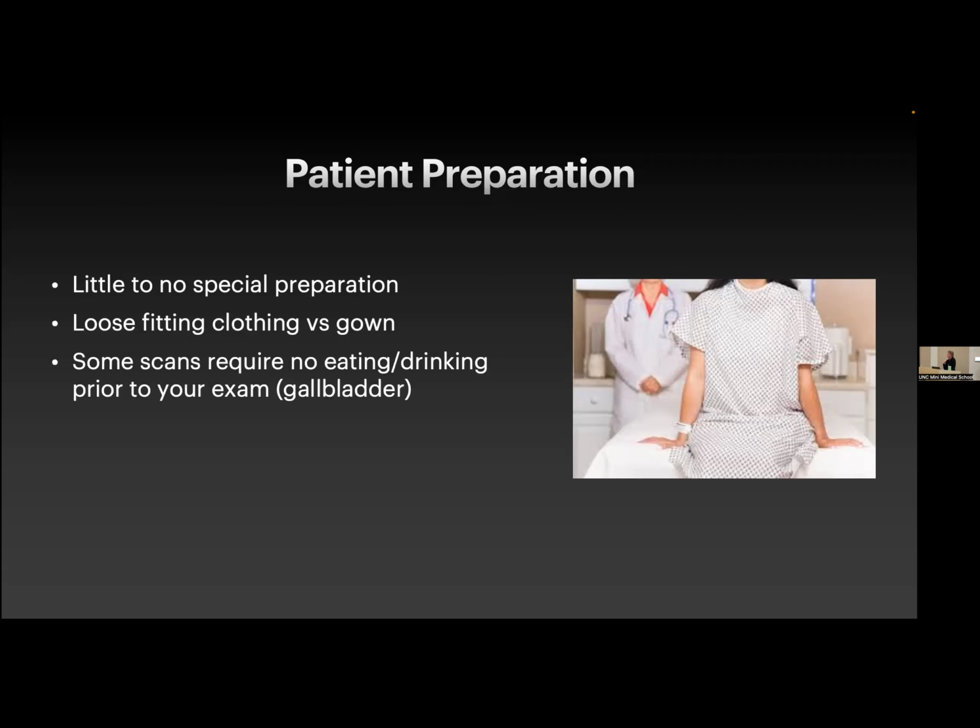So sometimes if we're looking for things like the gallbladder, if there's a gallbladder abnormality, maybe you have gallstones or they're worried that you have an infection of the gallbladder, which is what we call cholecystitis, we might ask you not to eat or drink before the study for a few hours.